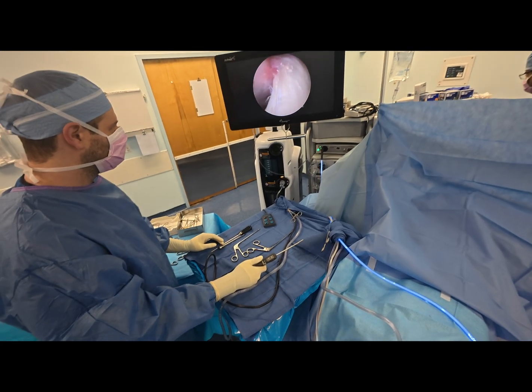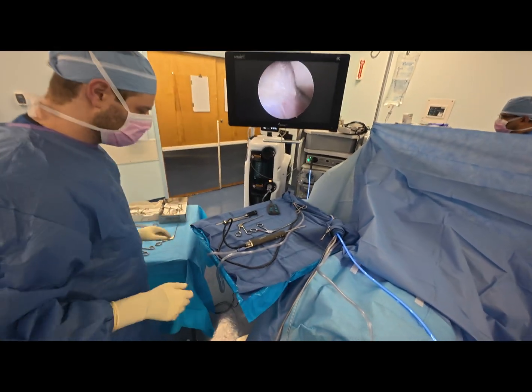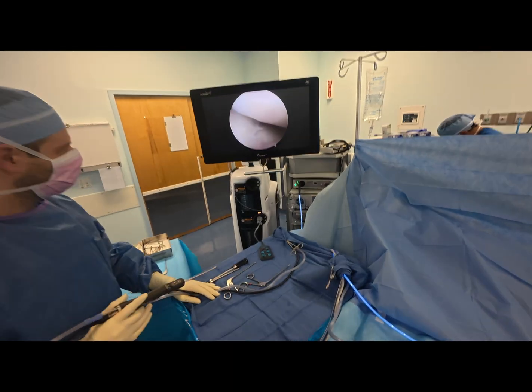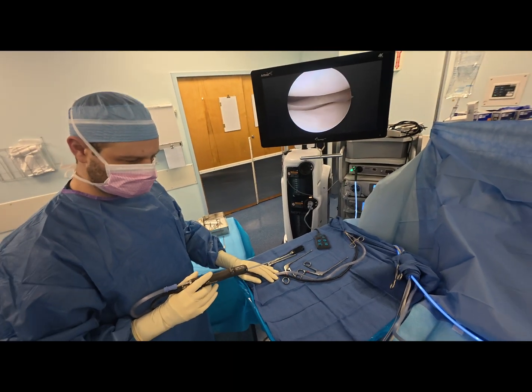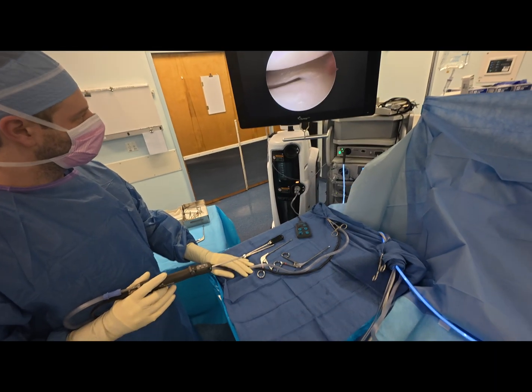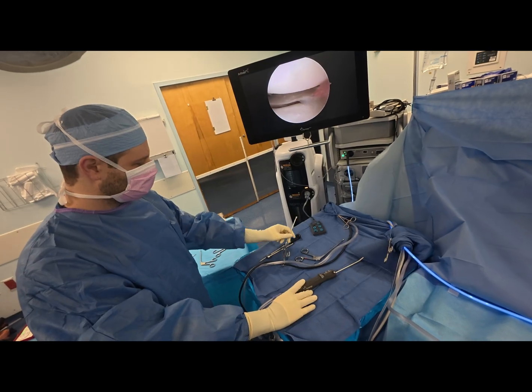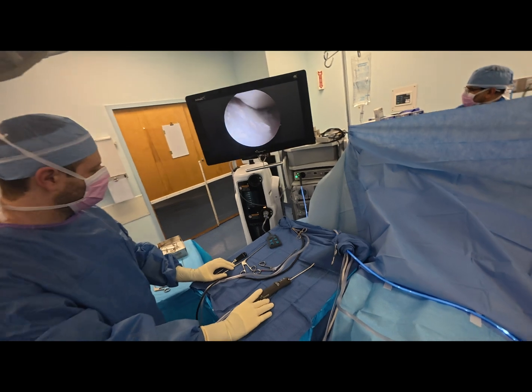You see some of the precipitation. I'm going to go into the lateral compartment, looking at that triangle again formed from the lateral femoral condyle, lateral border of the anterior cruciate ligament and the anterior horn of the lateral meniscus, then placing the knee in a figure 4 position, easily getting into the lateral compartment, open close, and you can see it looks perfect. Again, some precipitation of the probable Depo-Medrol injections versus a condition we call CPPD, chondrocalcinosis. Lateral compartment looks perfect.